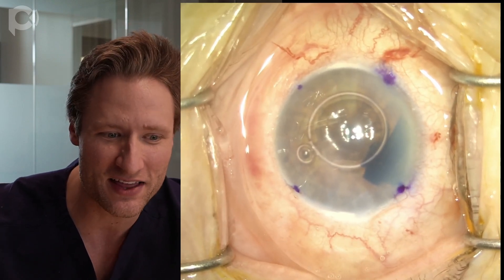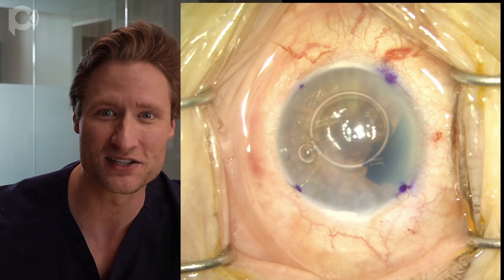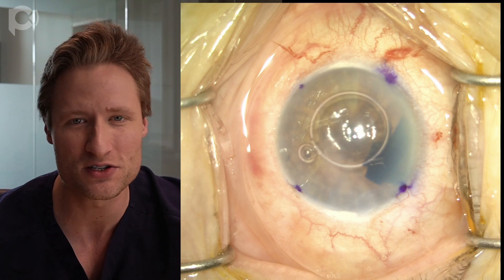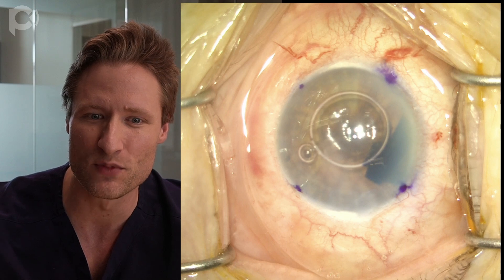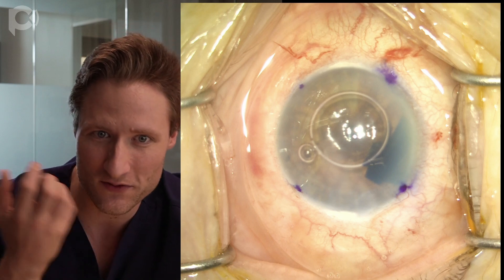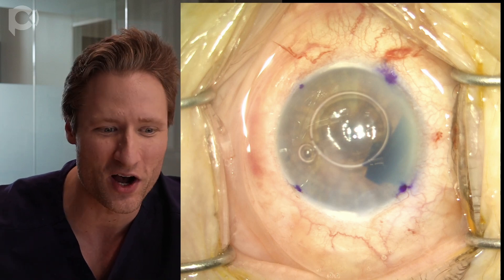Now I'm injecting the graft into the eye using a glass DORC injection cannula and injector system. I use this because that's how I learned to do DMEK in Holland, and it delivers a very minimal volume of fluid into the eye. With some DMEK injection systems, so much fluid is injected that the graft risks washing out when you remove the injector. With this injector, very little fluid enters the eye, so there's very little pressure wanting to wash the graft out.